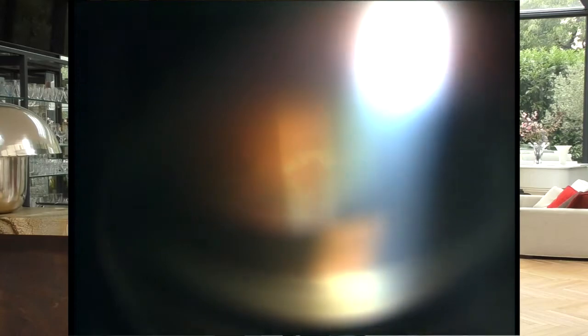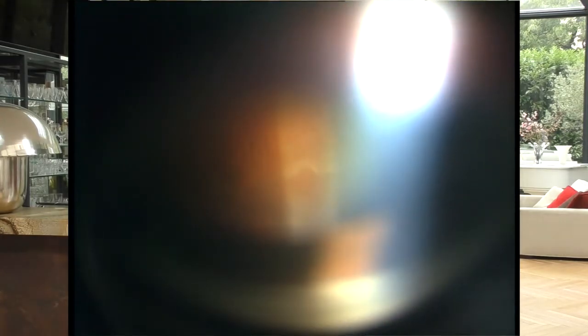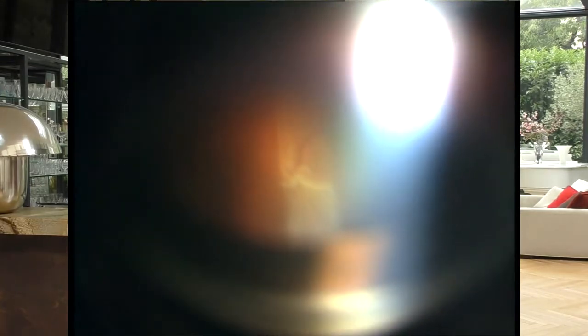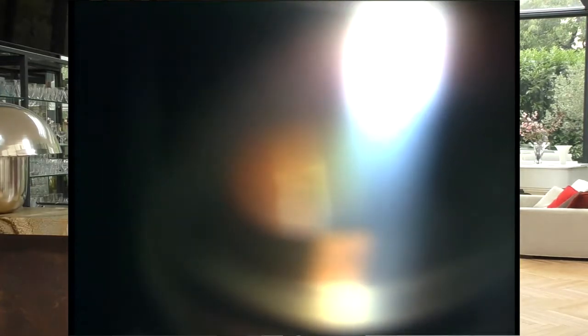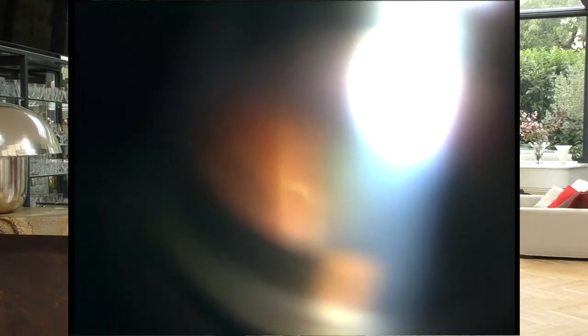In case of doubt, I go to magnification 45 and I write on my drawing all the information, either the open tears or the areas to be checked with cryo. You see that here all the tears are on the vitreous base, which appears as a small white line.